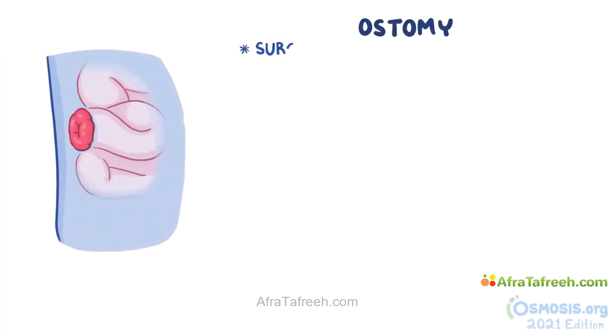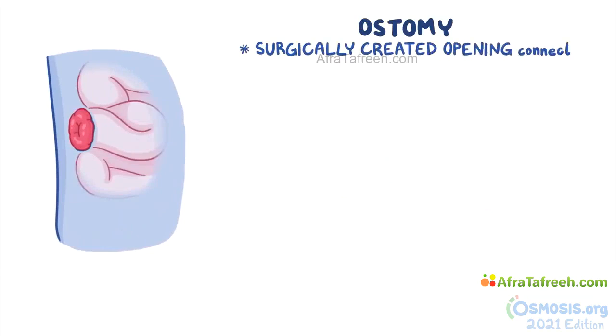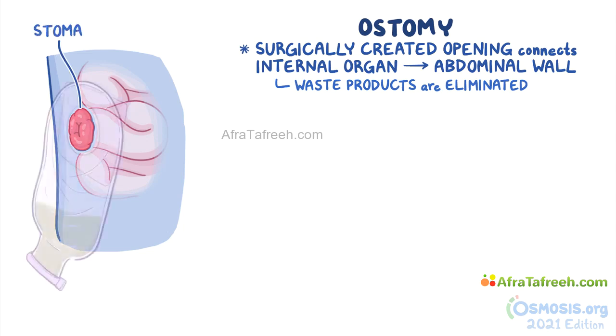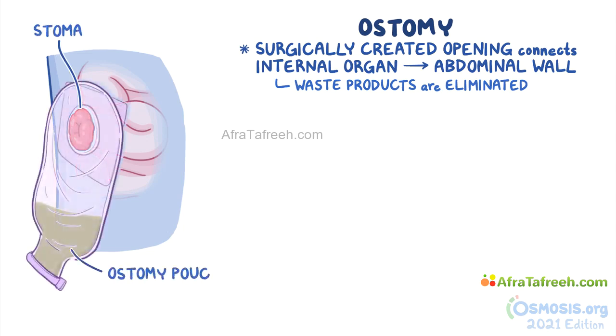An ostomy is a surgically created opening used to connect an internal organ to the abdominal wall, through which waste products, like intestinal contents, are eliminated. The opening that can be seen on the body surface is called a stoma, and it's usually connected to an ostomy pouch, also called a bag or appliance, where stool and flatus collect.